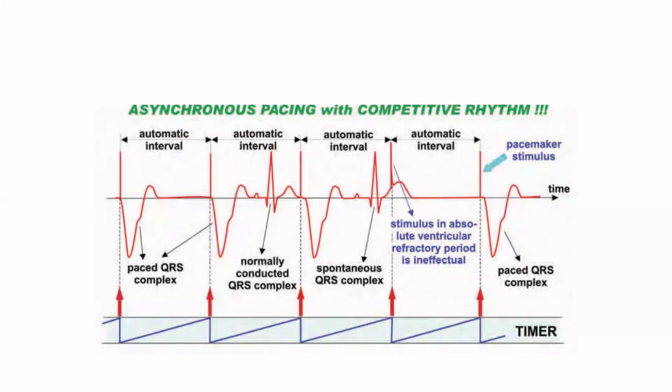This year we will use some advanced terms as we review because it's mostly a revision. So some terms may be used, like functional non-capture. What's meant by functional non-capture? That it's not the fault of the pacemaker. It just didn't capture because the myocardium was refractory.